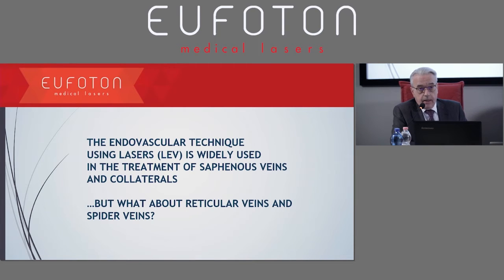15 years ago, we started by treating the great saphenous vein. At one point, we said, can we perform a treatment of small veins or more peripheral veins with the laser? We know that there are some cases.